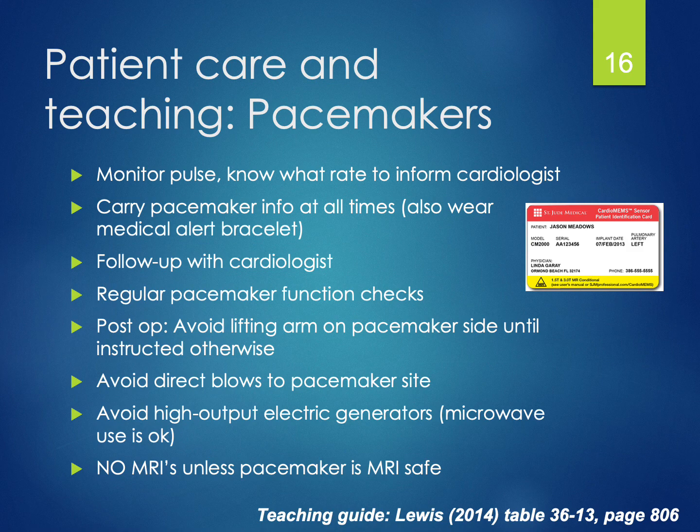These patients should always carry a pacemaker card, and that includes the manufacturer information, the settings of the pacemaker, and other key details about the pacemaker. If the patient ends up in the hospital, they can just bring this out and show it to their nurse and their cardiologist to make sure everybody's on the same page. They should also wear a medical alert bracelet indicating that they have a pacemaker. These patients will also need consistent follow-up with their cardiologist and have their pacemaker checked on a regular basis. This checking is often called interrogation or interrogating the pacemaker, and we're just making sure it's functioning properly.